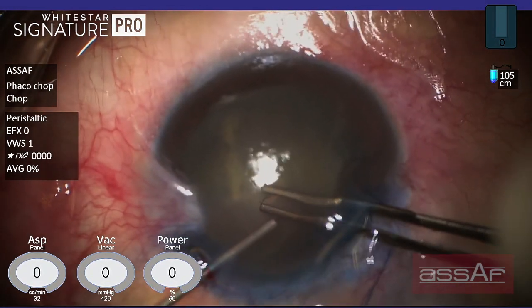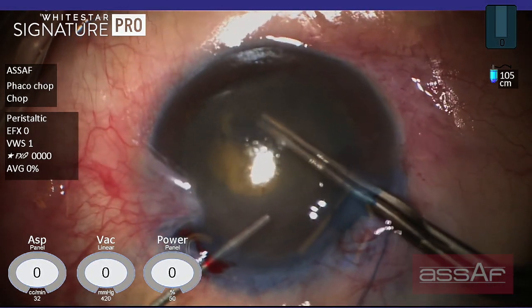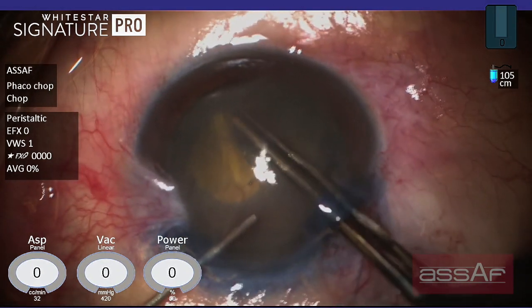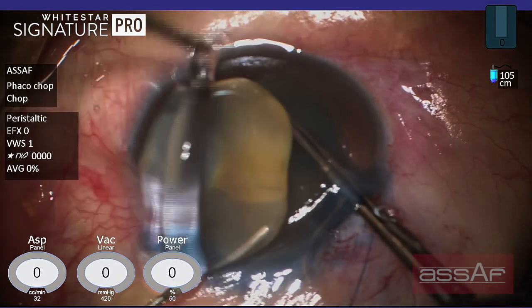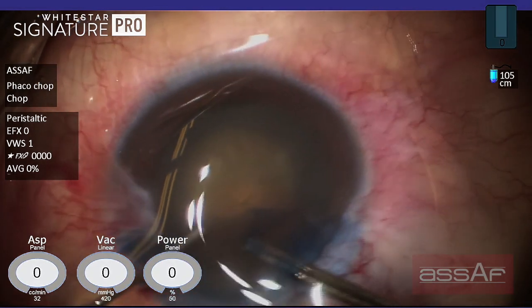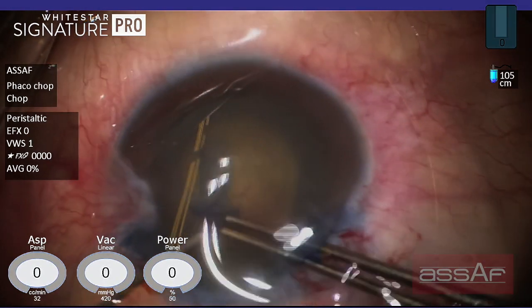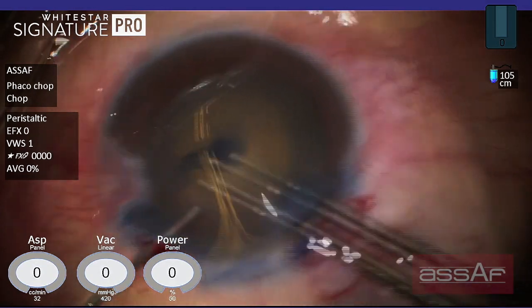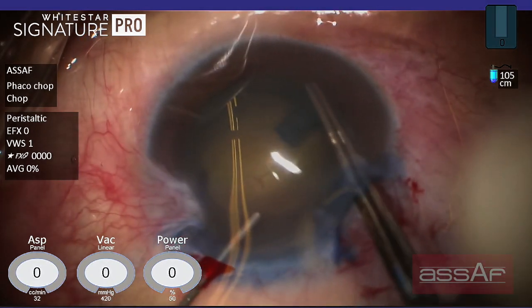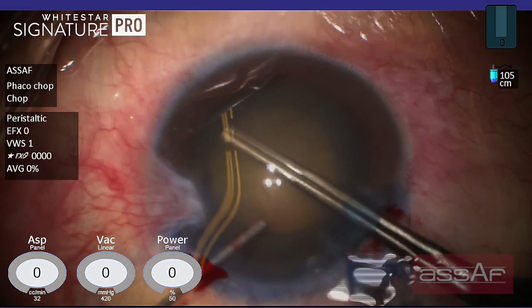Punctured the anterior capsule in the very middle. I'm sizing the lens capsule — I'm aiming in this case to 5.5 millimeter rhexis, not less. As you can see, the cornea is not in the very best shape, so applying methyl cellulose on the surface of the cornea to improve visibility. This cornea has some sort of corneal dystrophy in the form of diffuse corneal opacification and some corneal edema because of elevated IOP secondary to this dense cataract enlarged nucleus. We have done with the rhexis — adequate size as planned, 5.5 millimeter.